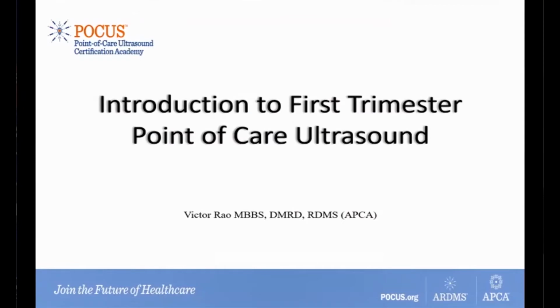Today, the topic of discussion is Introduction to First Trimester Point-of-Care Ultrasound. First trimester ultrasound is a vast topic, but we're going to address it based upon the guidelines provided by the ACEP and AAFP.